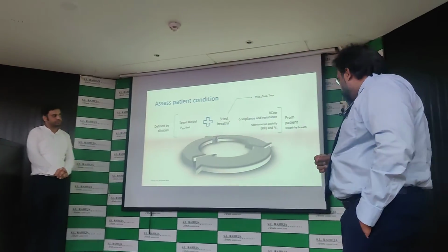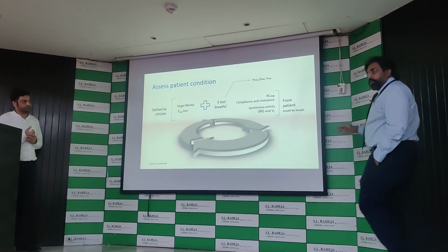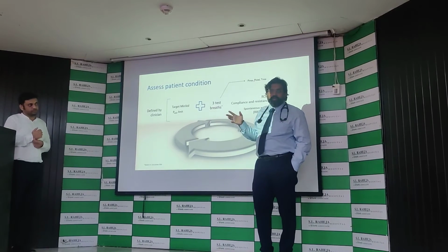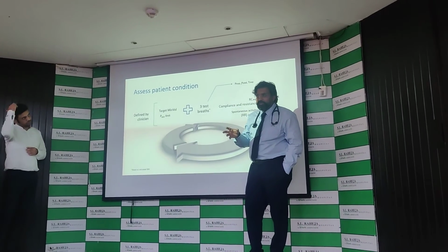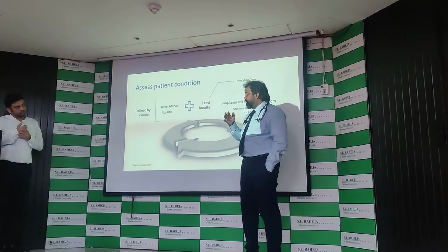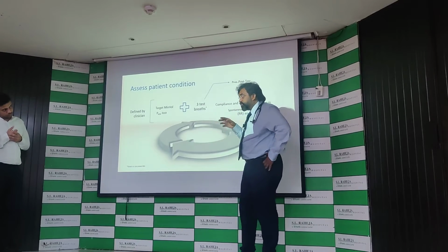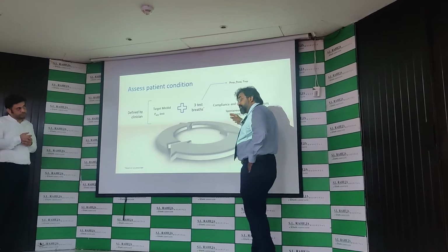So what does it do? The ventilator puts a breath to actually find the compliance and the resistance. It gives a pressure targeted breath, and with that, it calculates the compliance and finds out the resistance. Now that it knows the compliance and resistance, it puts it into the Otis formula, and then the Otis formula does it continuously.